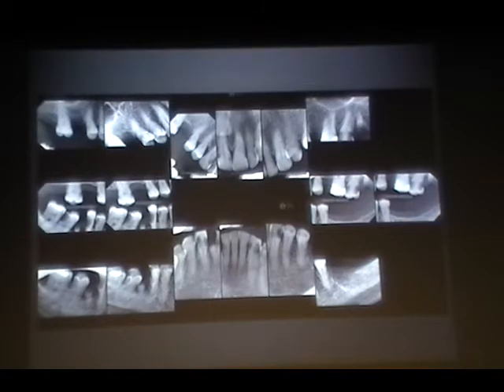Okay. Next one. Now, Bethany. Okay, here. Come on. So the image is too angulated. Yes, I have to literally see like this if I want to diagnose. Right?